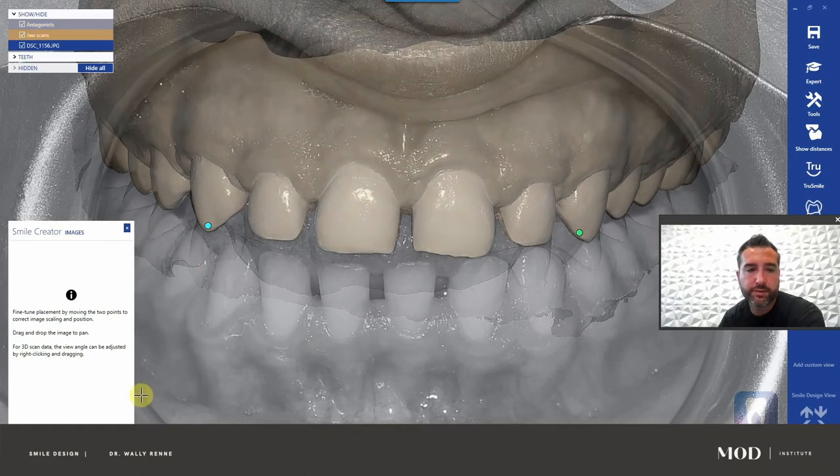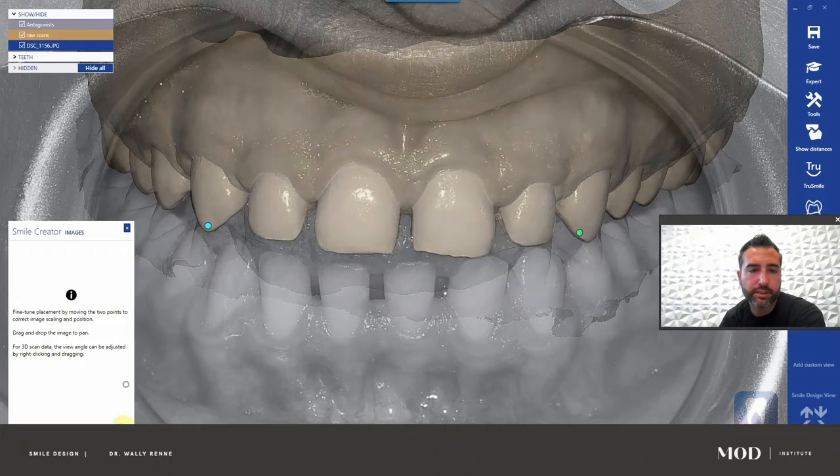Don't go crazy with ball movement — you probably had it right to begin with. The more adjustments you make with the balls in this stage, be careful. Minor, minor movements with the balls. Most of the adjustments in this stage need to be a right-click rotation of the model. This looks really pretty close, so I'm going to hit next.